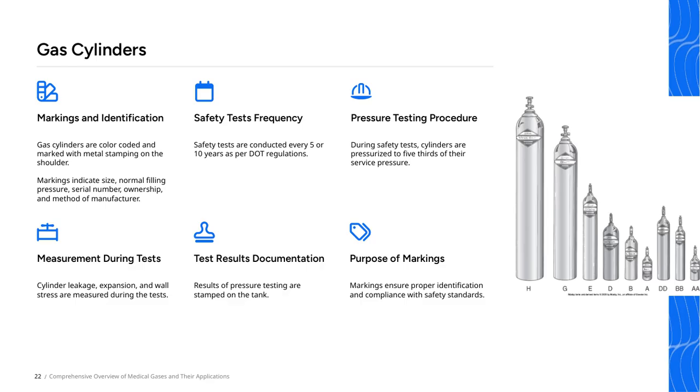Safety tests are not just one-off. They're conducted regularly, every 5 or 10 years, according to DOT regulations, to keep safety standards up to date.